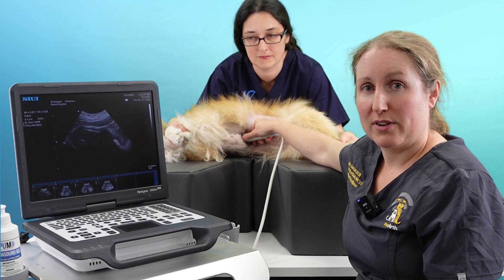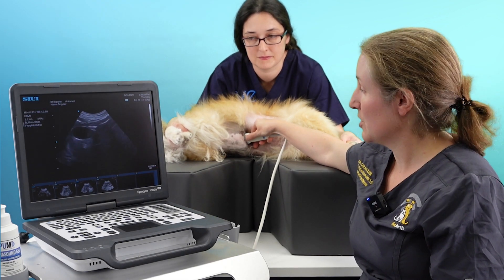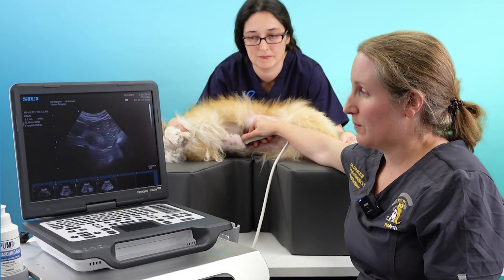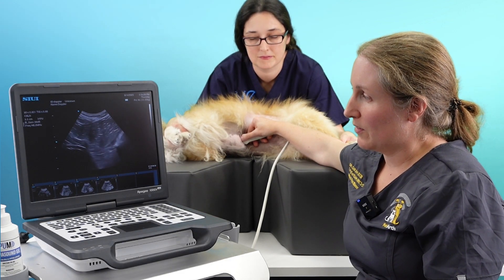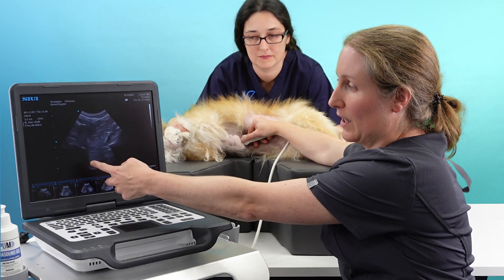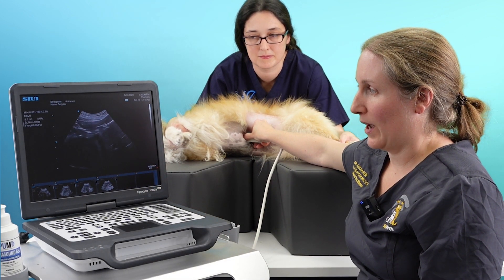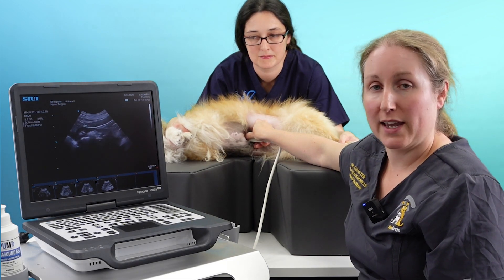We also need the opposite view, so we're going to turn the probe 90 degrees and do some fanning this way. This is off the liver this way, and we can start to see the heart coming in. Then we fan dorsally to go up the liver, and then we're off it onto the stomach.